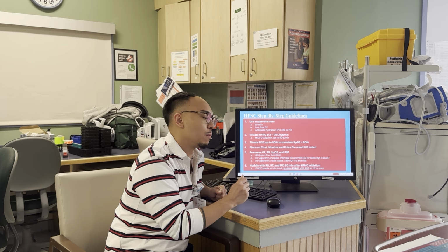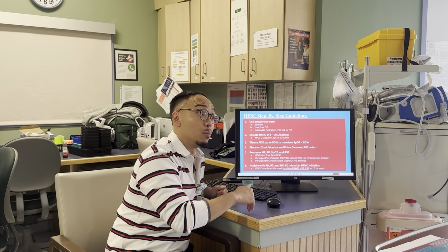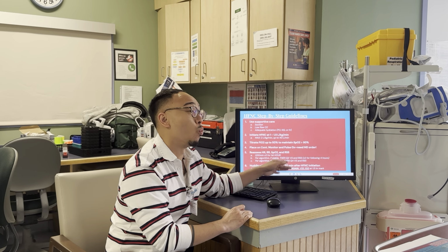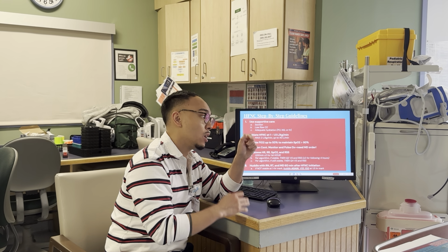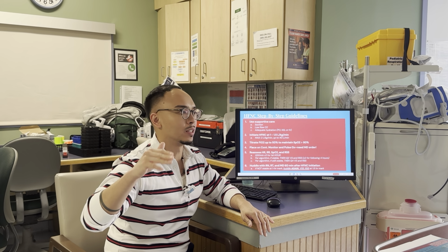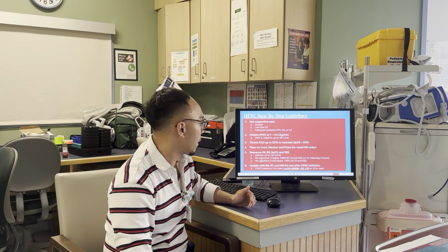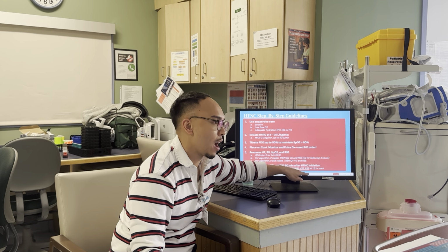So this is a crucial part because at this point, you all are on the same page whether this kid is stable on high flow or do we have to consider transferring out. So if not stable at the 1 hour mark, you're gonna huddle again at the 1.5 hour mark to see if your reassessments at the 1 hour are effective. So by the 1.5 hour mark, you should be able to tell if this kid is actually stable based on the increases in the flow, or again, if we need to transfer out. Okay? So that's important where you do a 1 hour huddle and potentially a 1.5 hour huddle.